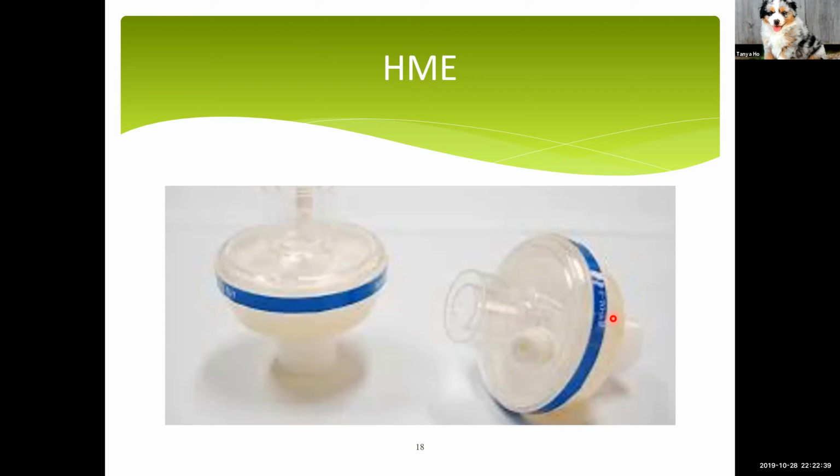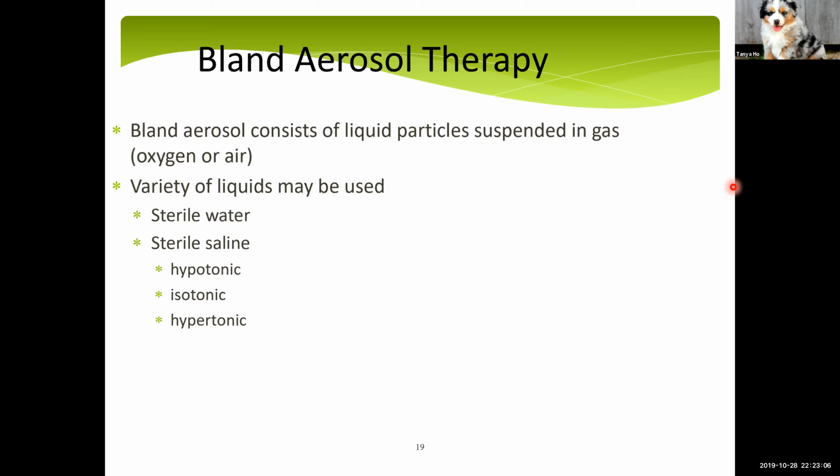Bland aerosol therapy. I just talked about an aerosol being water droplets that are suspended in gas. In terms of a bland aerosol, you could use sterile water or saline. These are the commonly used liquids.